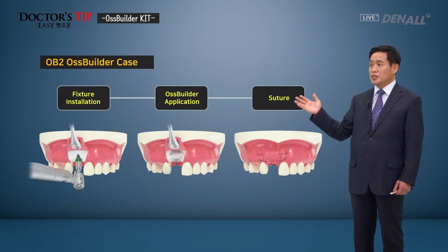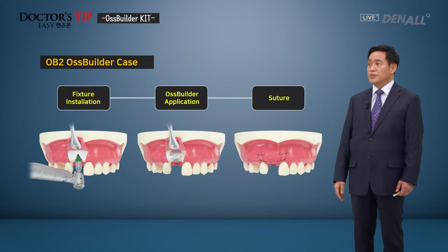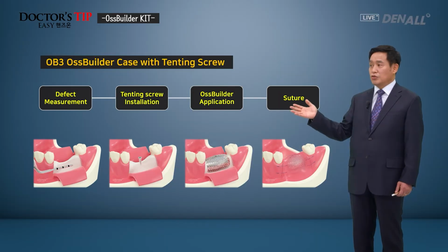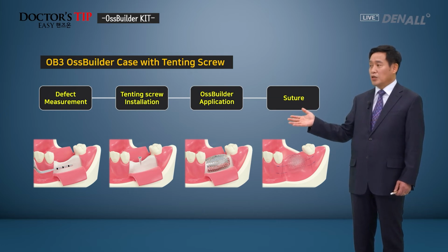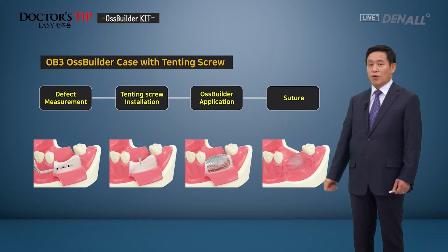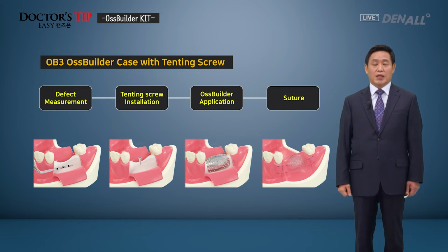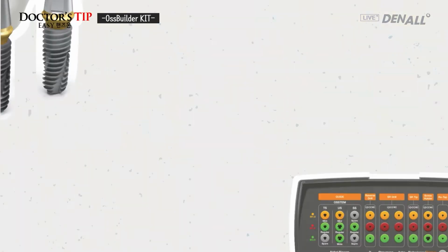The case for OssBuilder 2 is the upper anterior. The implant will be placed, OssBuilder will be chosen and applied, and suturing will be done. The OssBuilder 3 case is in the lower posterior, where I'm going to measure the defect. Because immediate implant placement is impossible, I'm going to do two-stage. When I do GBR, I connect the tenting screw, adapt the bone graft, and apply OssBuilder. After that, I'm going to suture. I'm going to show you the hands-on practice shortly.